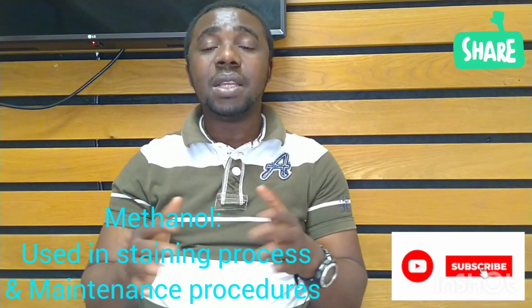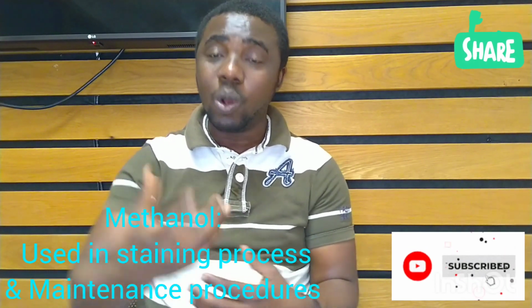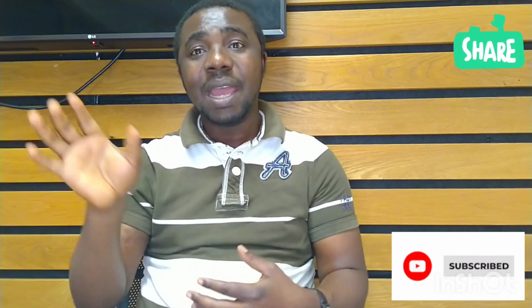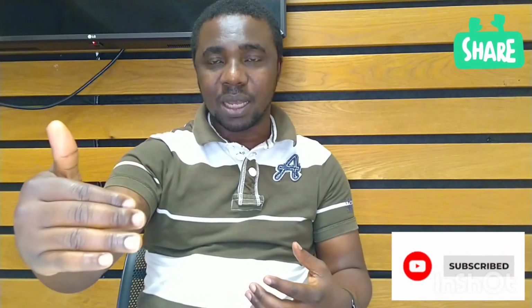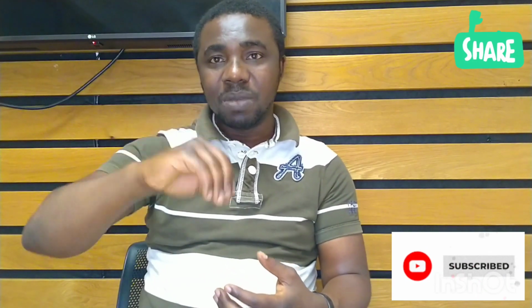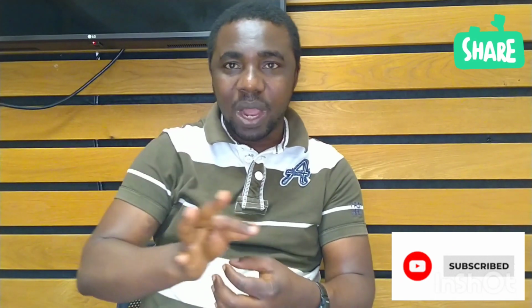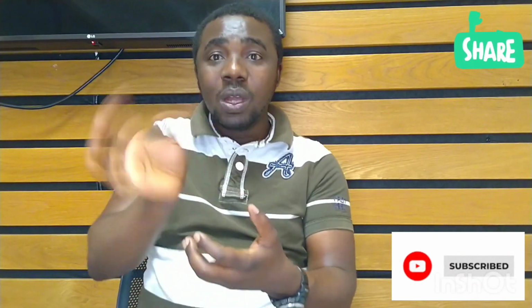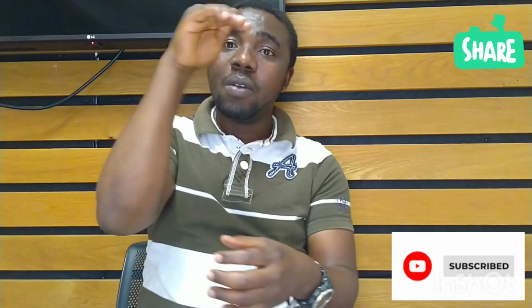So methanol, like I've said, can be used to fix the slide after it's been made. Following the drying, once you make the film, you allow it to dry. In fact, there's something I need to say before I go ahead. Once the sample goes into the analyzer, it will aspirate the blood, mix it, then aspirate the blood. Once it aspirates, it has a slide which it uses to make the film. Once it makes it, it has an inbuilt fan that will fan it to help it dry. Then following the drying, it can push it, in a rack, to now be fixed.